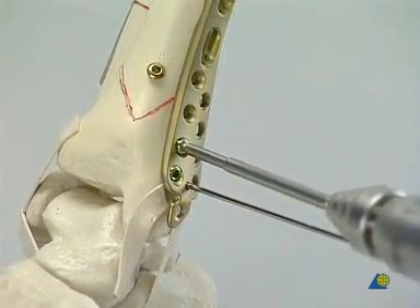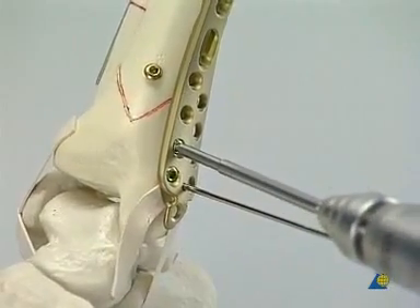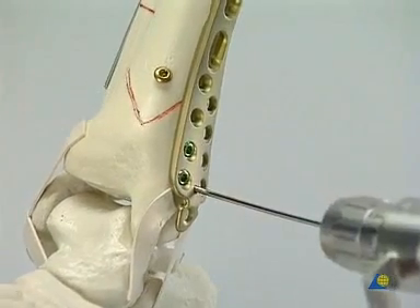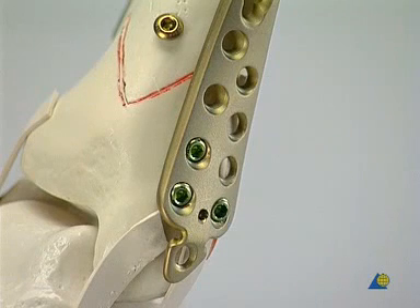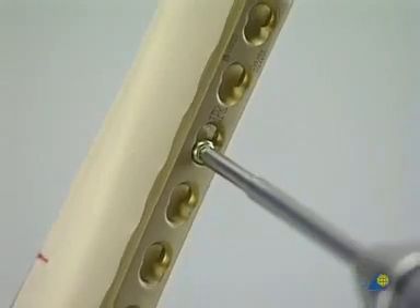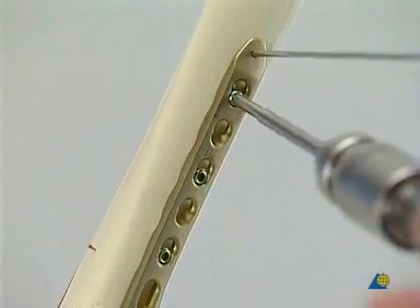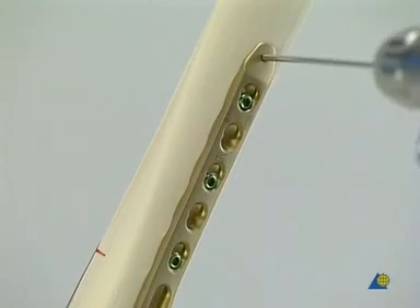The next screw is inserted in the same manner. The plate is not pressed against the bone, which avoids unnecessary squeezing of the periosteum. The K-wire is removed before the third locking head screw is inserted. Now the plate is well anchored to the short distal fragment. Moving proximally, a stab incision is made to approach the third plate hole and to introduce the drill sleeve for percutaneous screw placement. Two more locking head screws are inserted. The K-wire is removed to finish the fixation.